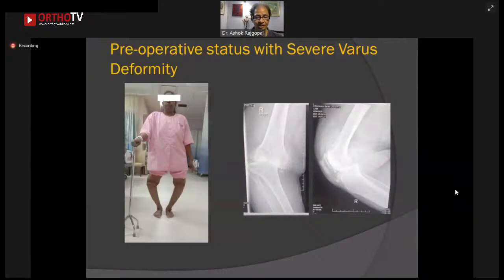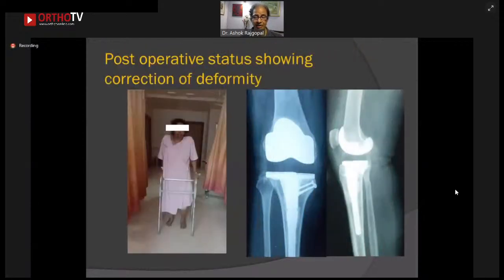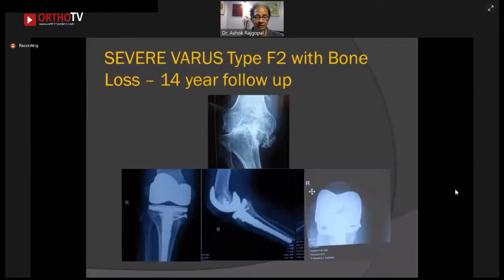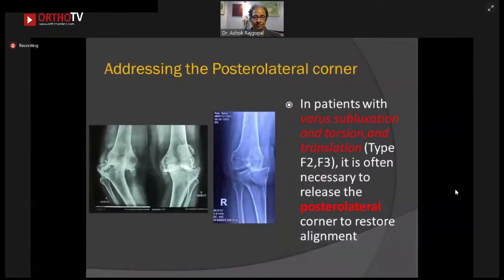So this is a very severe deformity. As you can see, this is pretty much what we would call an F2 variety. This is post-operative correction. We have used primary implants, a CR implant, with the restitution of alignment and maintaining the position of the joint and the patella. Another patient, 14-year follow-up with gross deformity. Again, you can see the interosseous space is maintained over here. So this again comes into what we would call an F2 variety. You can see the restitution of alignment, good patellar tracking. This is at 14 years.